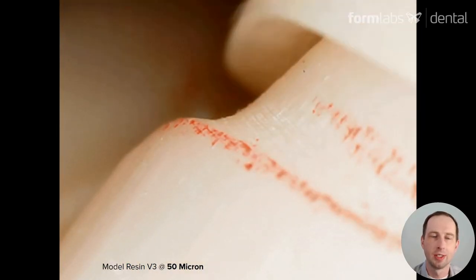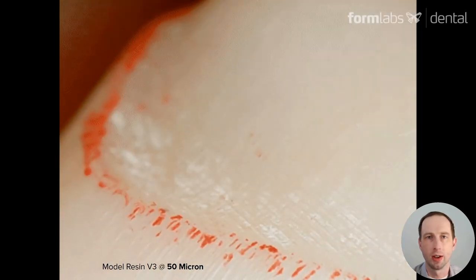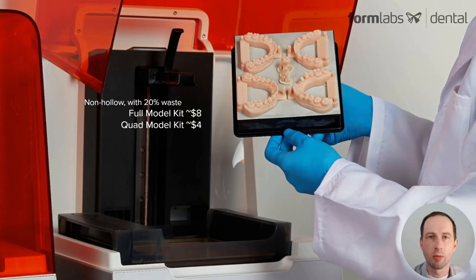Here's a magnified view of what seating a zirconia coping looks like on one of our model resin dies. And just like our previous generation, with non-holo models with 20% waste added, you can do a full model kit for about $8 and a quad model kit for about $4 — and that means the upper, lower, and the dies all together as a kit.